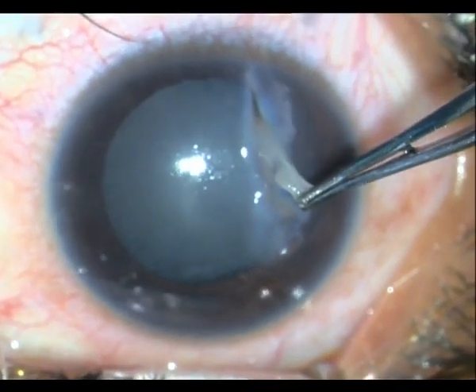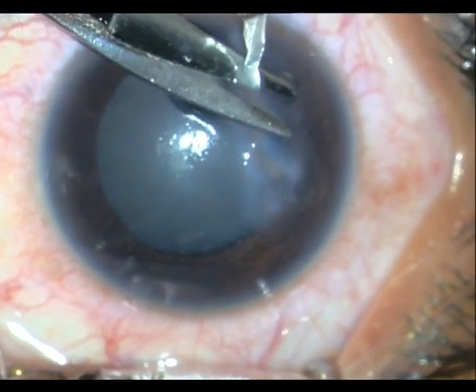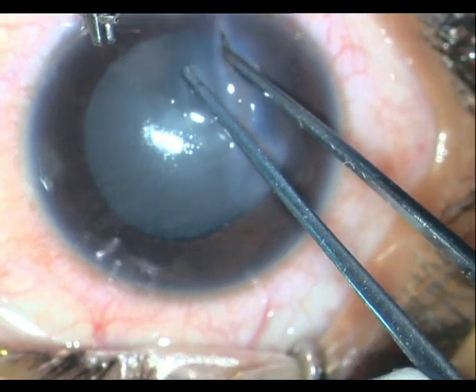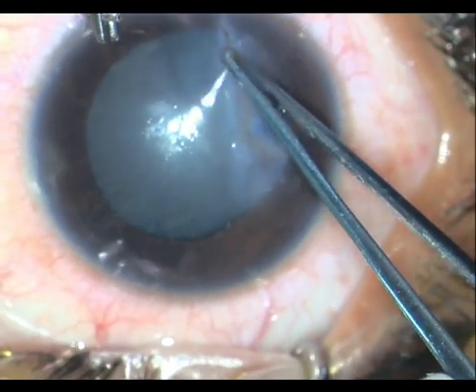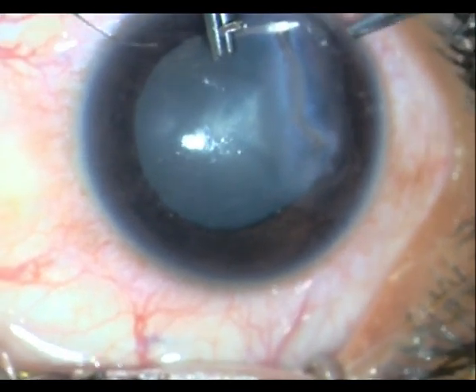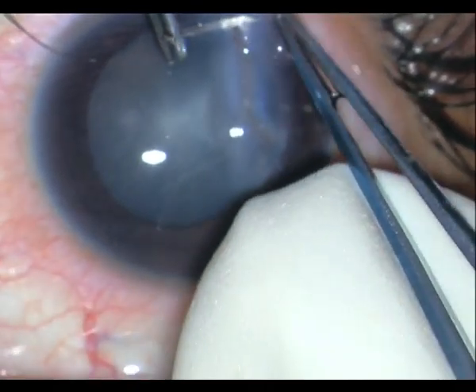We decided to take him up for surgery. At this point I am trying to cut off all the membranes over the wound and also perform wound toilet. It is very important when suturing these wounds — one big complication is epithelial ingrowth — so there has to be a very thorough wound toilet.